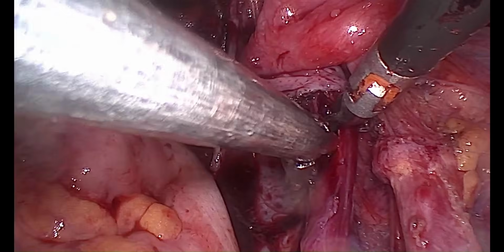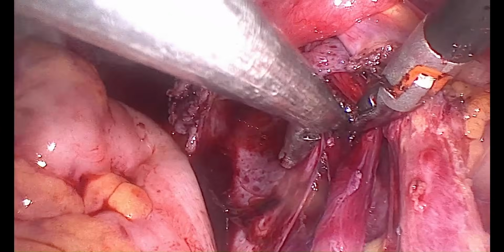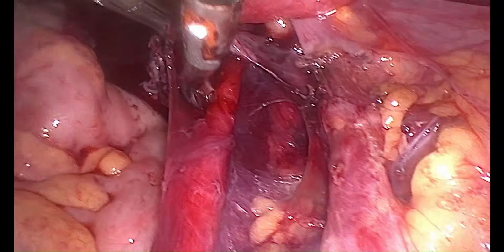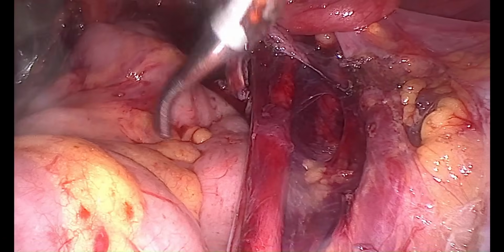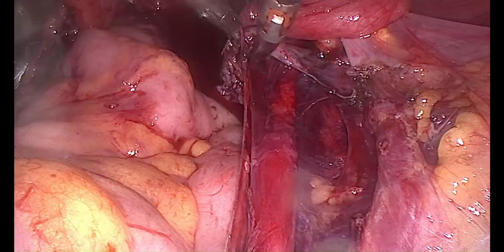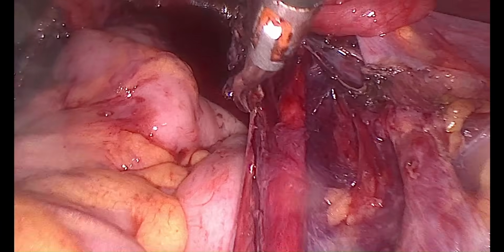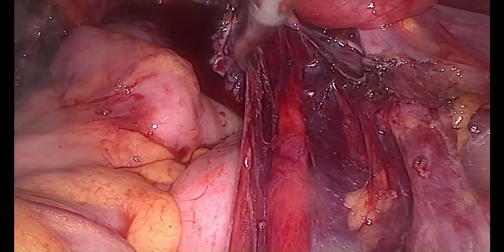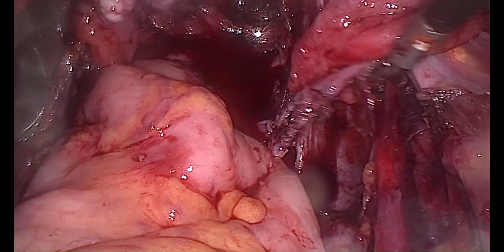The same ureterolysis, because this is the video of ureterolysis, we are going to show you the ureterolysis on the right side. And as you can see, you can use just a needle holder and the bipolar sharer. This is the sheath, and if the ureter is not going to get dissected out, you can just do a nicking of the ureteric sheath. You will come one plane above and start dissecting it out down, and this procedure will be helpful for dissecting this particular disease and going to do a peritonectomy later on.